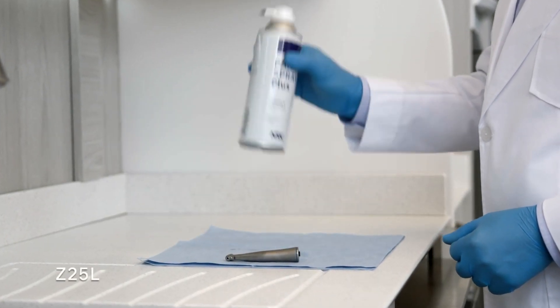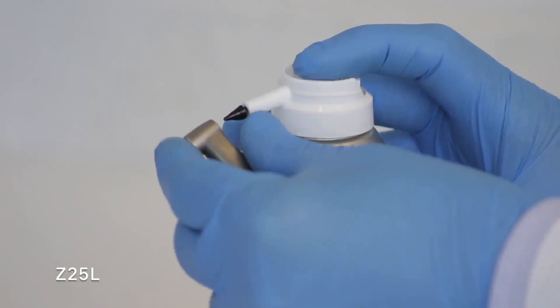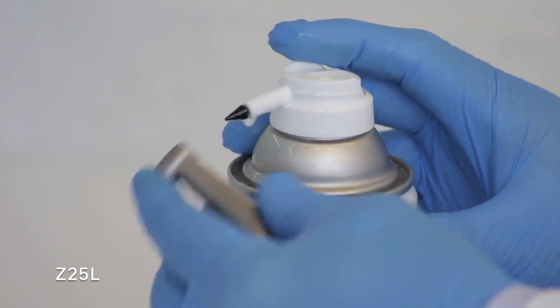Now here's the process for a Z25L slow-speed attachment. Shake the can three to four times. Hold the can in an upright position. Insert the nozzle directly into the chuck and spray for two to three seconds.